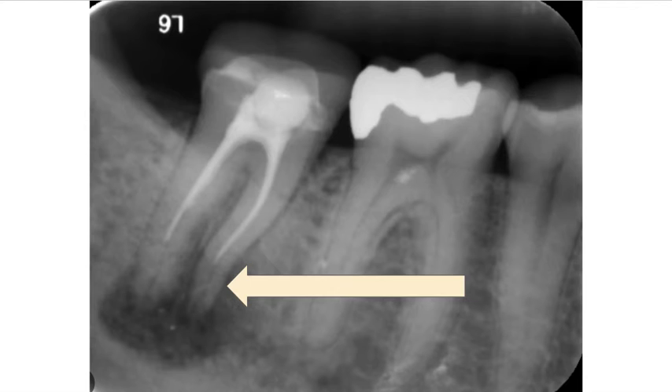It might be important for us to quickly go over what are the kinds of obturation. We have carrier-based obturation, which is essentially delivering gutta percha with a handle and a delivery tool or a carrier. They come in various forms. Then warm vertical, which is the most standard and probably the most utilized by the endodontist method of obturation. Then we have cold lateral, which I don't understand why is still taught in dental schools. There is also a newer one: single cone technique with bioceramic sealers — topic for another day.